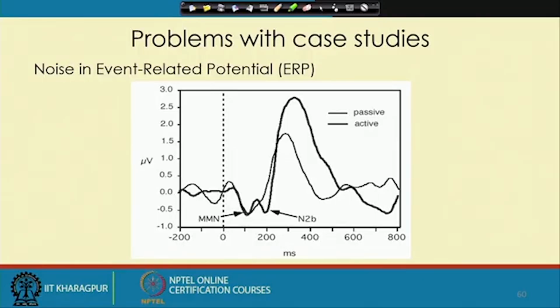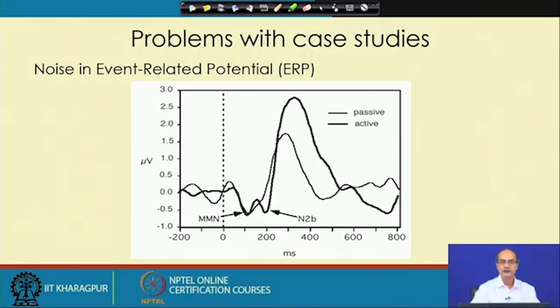The next important point for synchronous averaging is we need to align the signals, because without aligning, if we add them, the signal components can cancel each other. They would not have a reinforcement effect. So, we need to align them together, and the trigger for alignment can come from different sources. First, it can come externally. For example, in this ERP we are playing some tune. The point in time when the tune is played is marked here as 0.